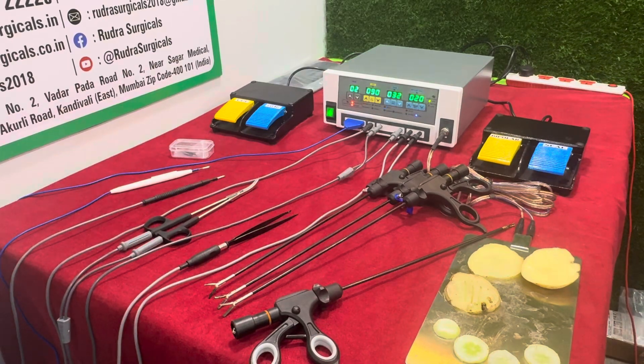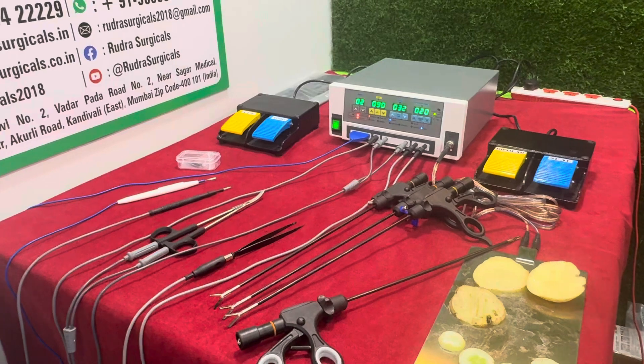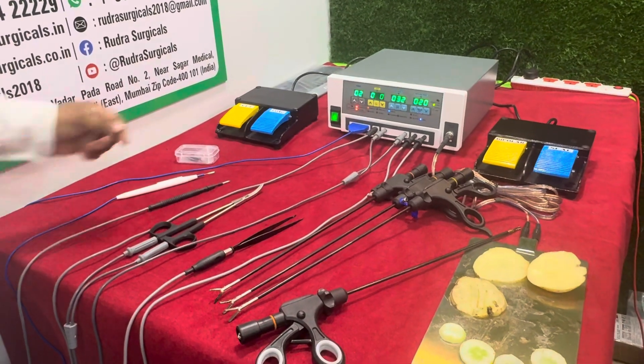Hello everyone, this is Rudha Surgicals from Mumbai, India. Today I am going to explain about the bipolar seal and cut cautery machine.